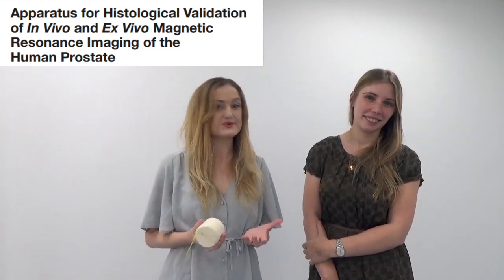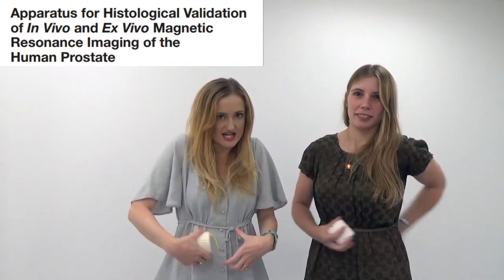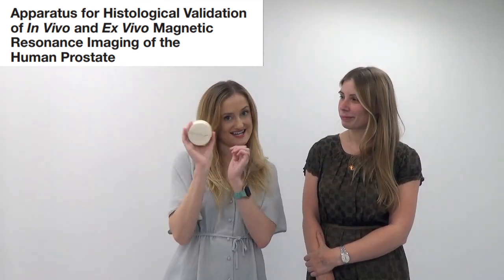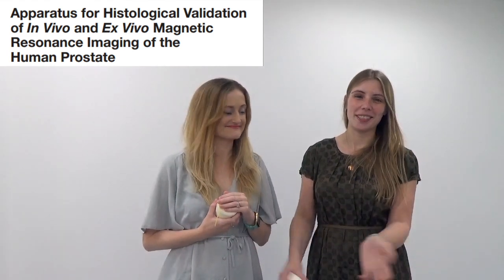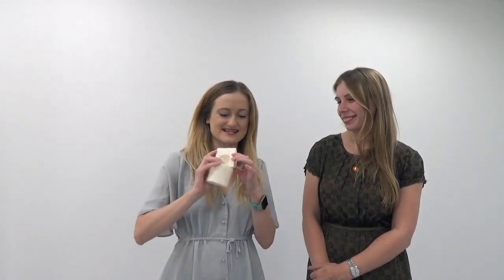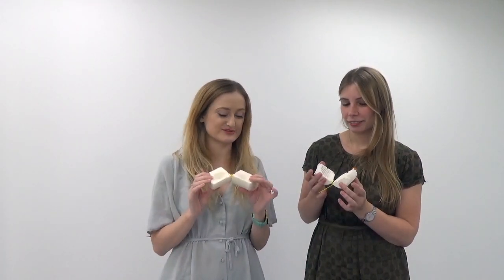The 'in vivo' part is talking about that MRI scan the patient had before their surgery - in vivo just means still in your body. Ex vivo is outside of the body, so that's the MRI scan that happened of the prostate in the apparatus. MRI is magnetic resonance imaging. This is quite a technical paper about the apparatus, which was for the most part arranged by Roger, who makes these amazing personalized molds - because each one of these is personalized to a specific patient's prostate.